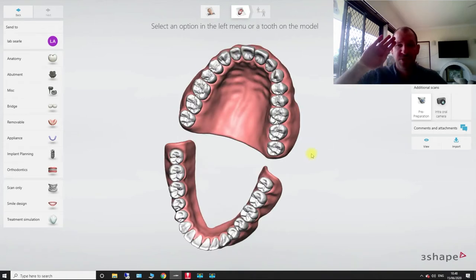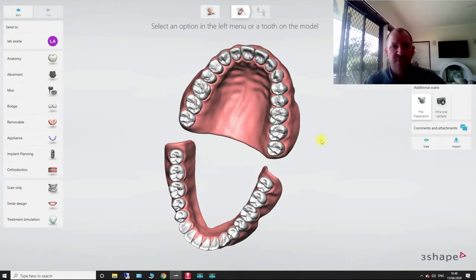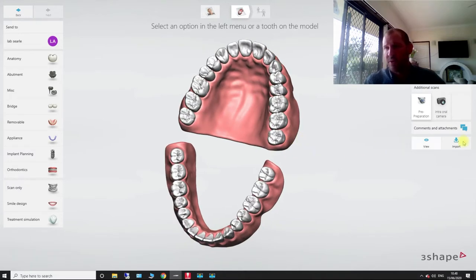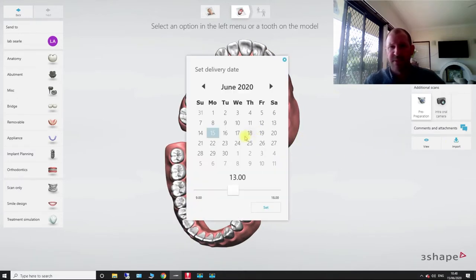Hi guys, it's Matt here from Henry Schein, just doing a really quick video showing you the workflow to do when you're going to be restoring an implant that's been placed.